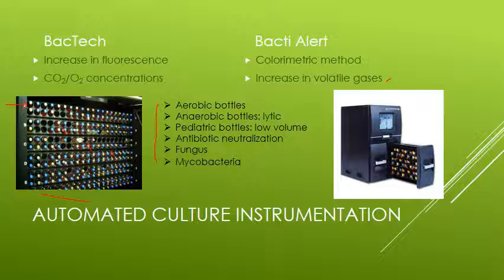And then, of course, we have mycobacterial bottles. That's usually a whole different machine. BacteriAlert and Bactec both make one. You have the MGIT system, and you have the BacTB or something like that. I forget the name of it. It's a fancy name. But basically, those are machines and bottles that are specifically tailored to the very long incubation times for Mycobacterium. And of course, it includes antibiotics to keep down normal flora and things like that. The specimens still have to be processed. It's not like you can just collect a sputum specimen and inject it into a Mycobacterium bottle.